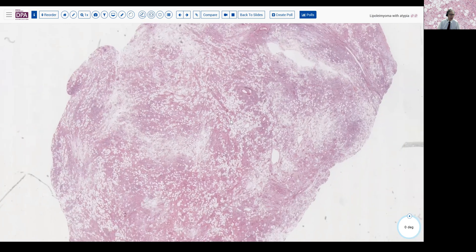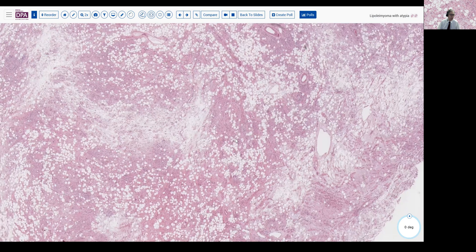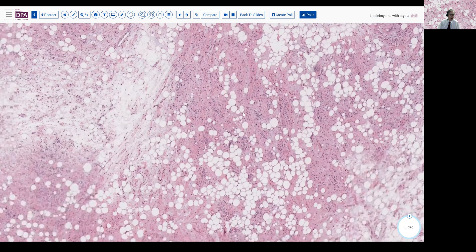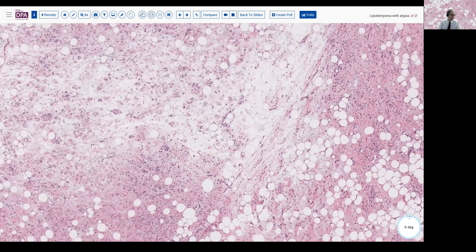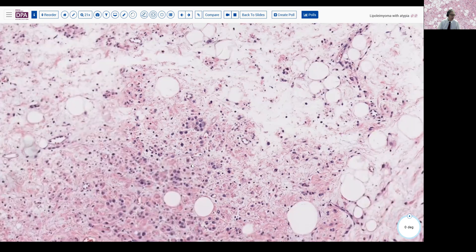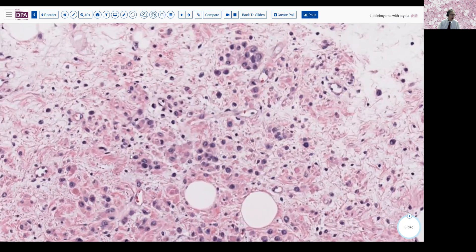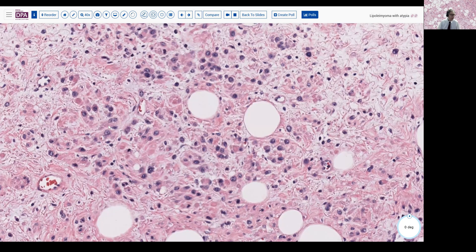As we come in a little bit closer on this tumor, we see that there's some variability in cellularity, and a few medium to large-sized vessels as well, as this fairly abundant fat around in different areas. Now, in a few areas, the cells show a degree of atypia. We see a few cells that look here as though the nuclei are rather large, although these surrounding cells here are fairly small relative to the size of the nucleus. And there's a degree of pleomorphism here.